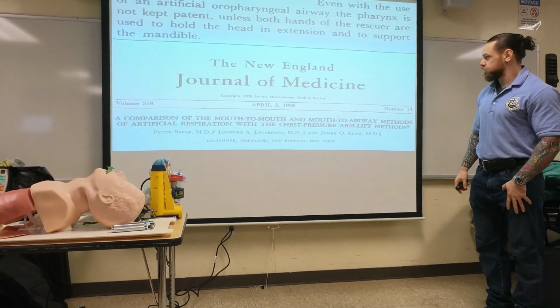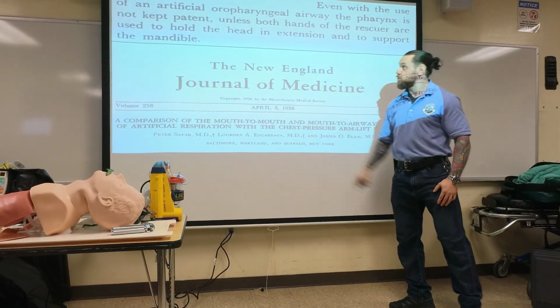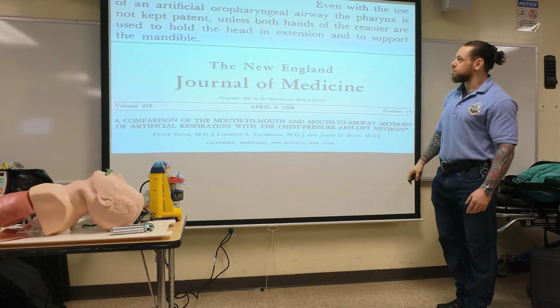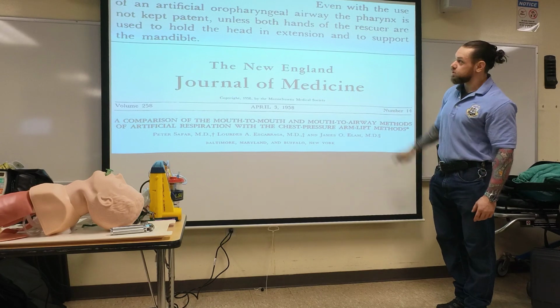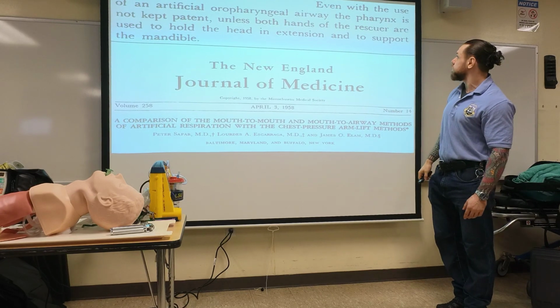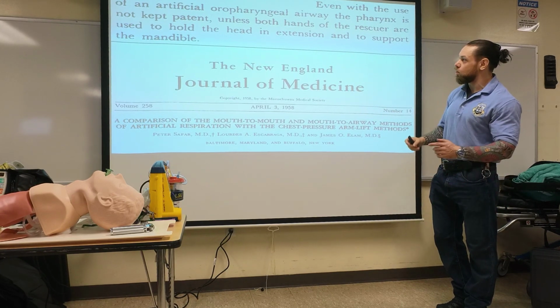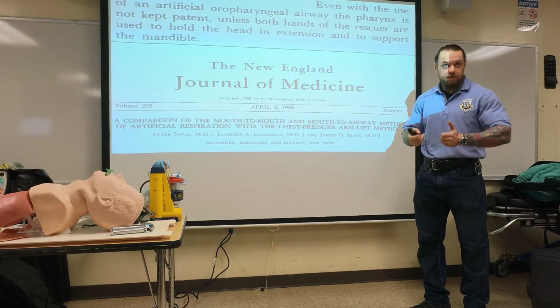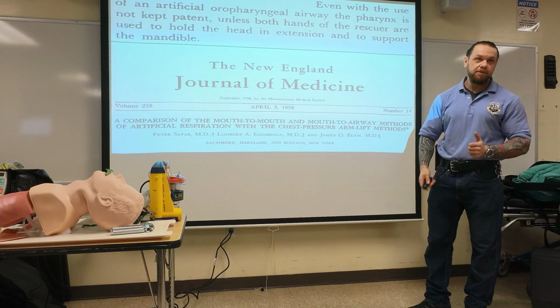You notice the ear. They said, even with the use of an artificial oropharyngeal airway, the OPA, the pharynx is not kept patent unless both hands of the rescuer hold the head in extension and support the mandible. That basically means you lift the mandible and you extend the head.